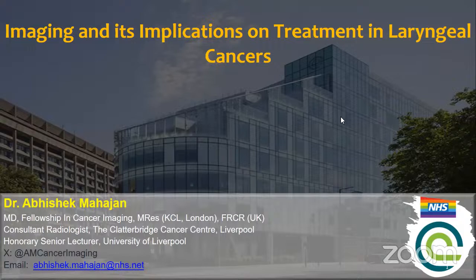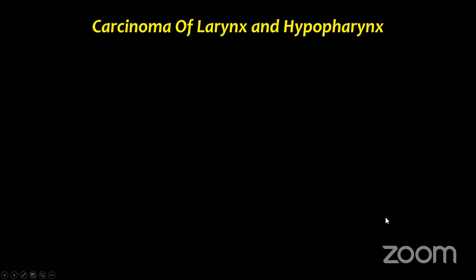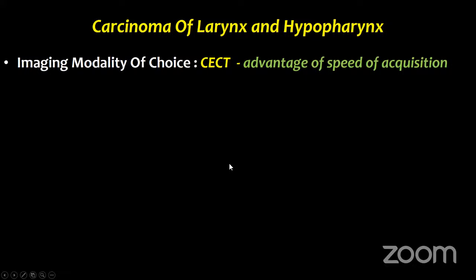Thank you, and thanks to Aseem and Sabani ma'am for giving me this opportunity to speak on this topic. In the next 20 to 30 minutes, I'll pass through the anatomy and various critical structures which imaging explores, the extent and the spread, which have implications while planning the management of these laryngeal and hypopharyngeal cancers. Imaging is complementary to the clinical examination as well as the endoscopic biopsy, which is routinely done in patients with laryngeal and hypopharyngeal cancers. But subtle abnormalities and spread into some spaces and fat planes are not seen on endoscopic examination. And there comes the role of imaging.